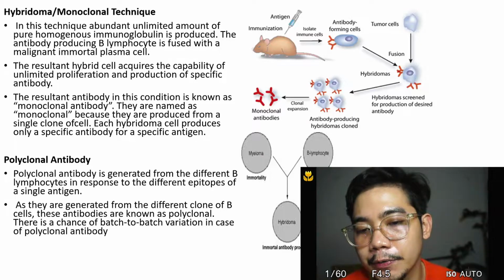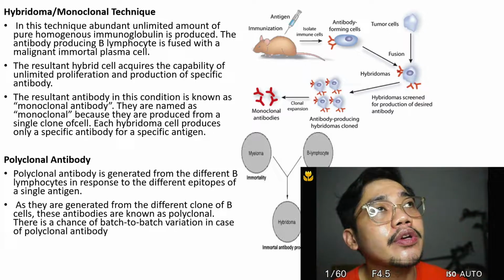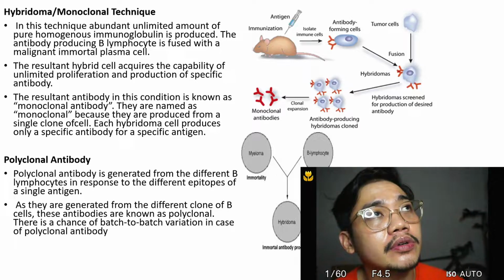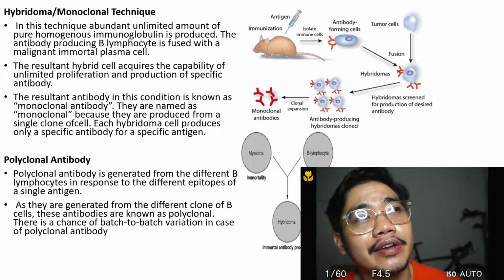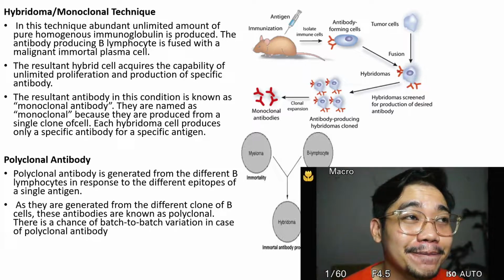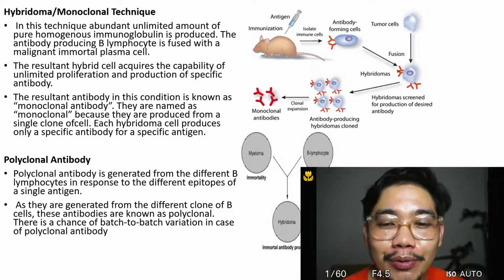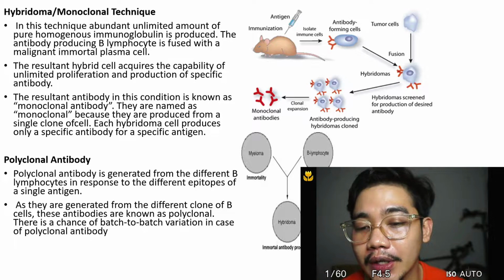So this is how you produce commercial antibodies, because you can't manufacture them in the laboratory. It's quite complex.